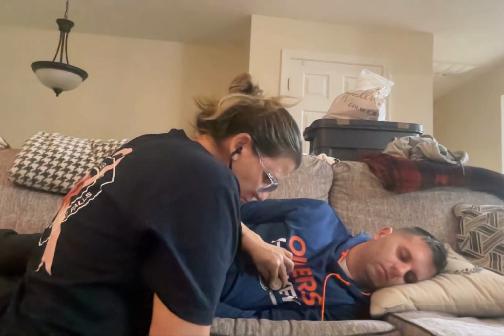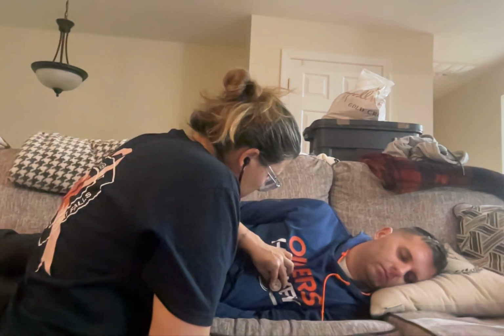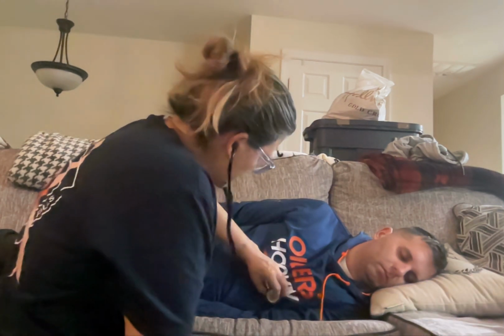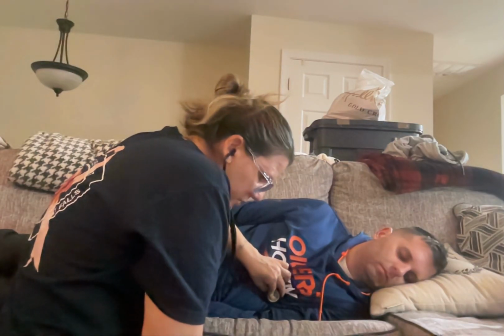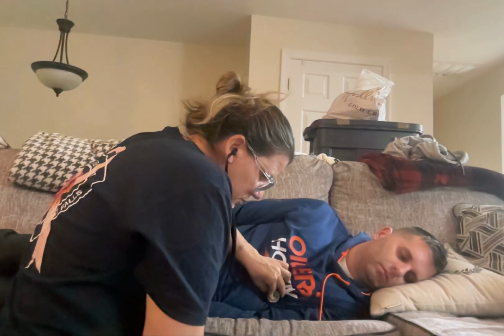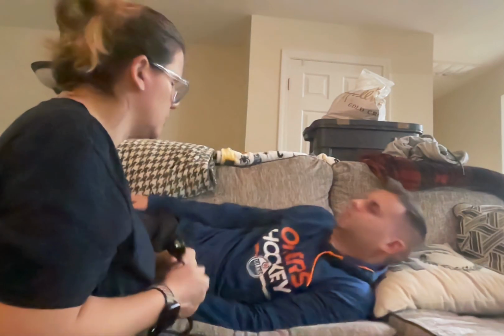Tricuspid. I'm listening to that mitral valve over the mid-clavicular line. All right, you can go ahead and lay on your back.